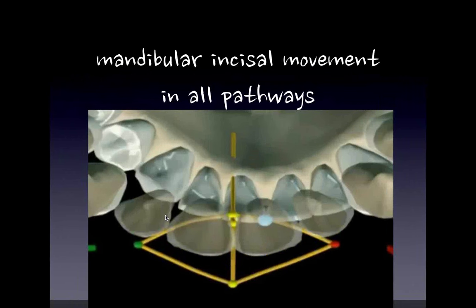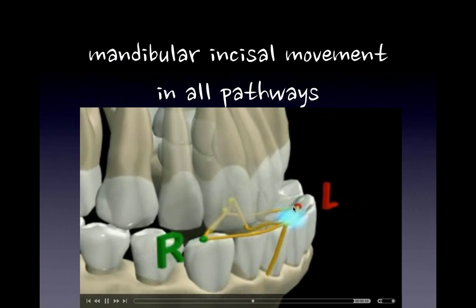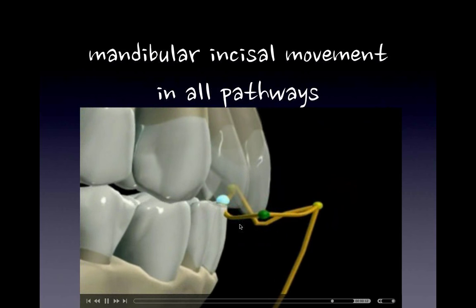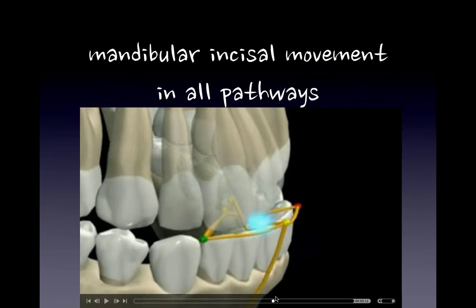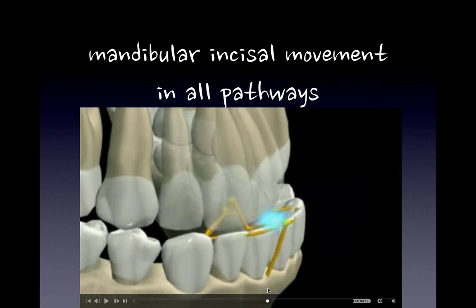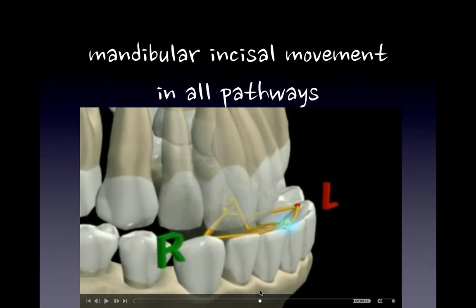Check his occlusion again. And here's a good trick to really remember that in occlusion, their centric position is always when they go back. They go back into centric, and then they come forward. But we have to always check them outside of their parameters. You never know what they're doing when they're outside of their parameters. So I'm constantly checking right lateral and left lateral, and that basically means right over here. When they're all the way out to the left, right there, see if there's any contact when they go back and forth from that position. It's not just protrusive to the edge. It's protrusive all the way out. You follow that? So when they're moving all the way out, sometimes the canine hits, right? So we want to look at all the possible motions of the protrusive, not just at the edge, but further out. So I'm constantly looking at that.